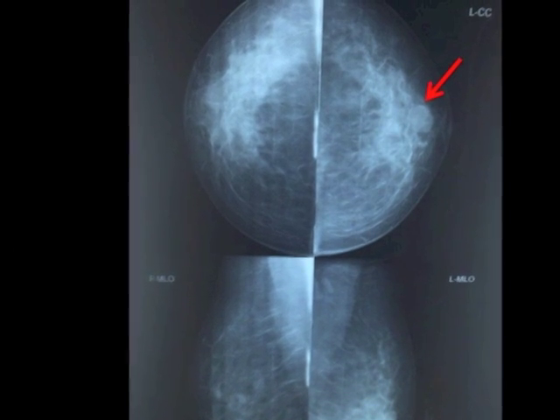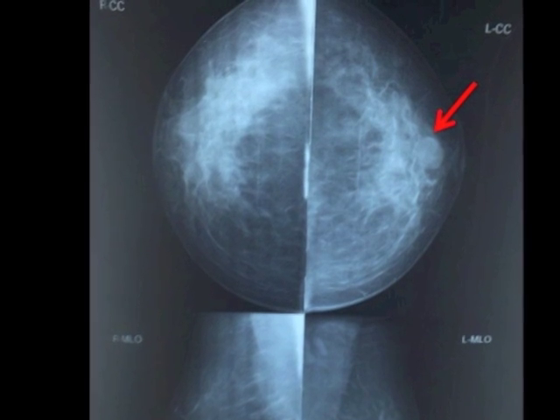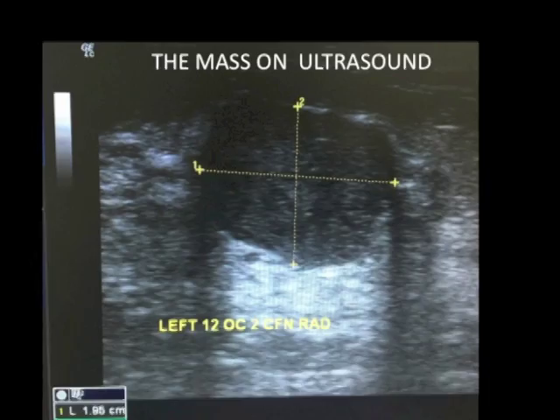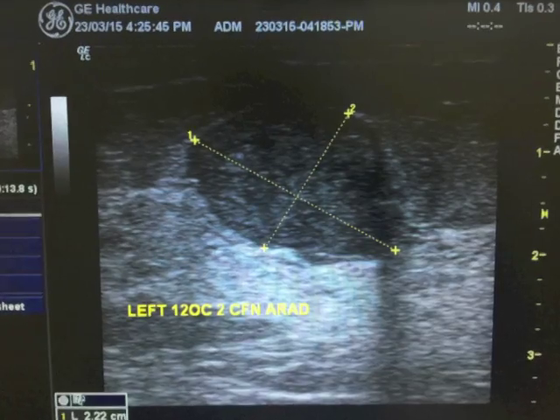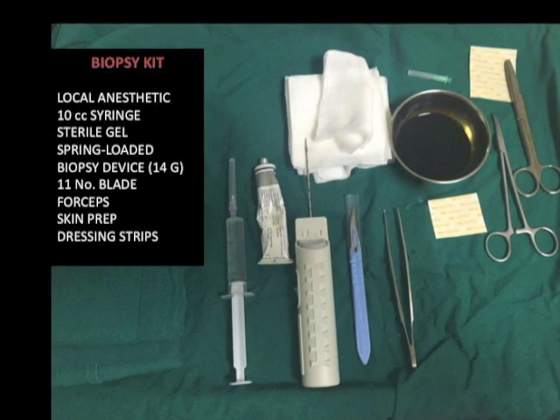I am going to demonstrate this case of a 43 year old female who presented with a left breast mass noted on mammography. The same mass is localized on ultrasound and its dimensions are measured. The biopsy is done in the outpatient ultrasound procedure room.